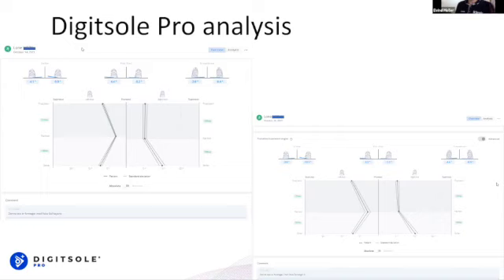As you see, the left foot is very perfect. Every step is always the same, and the same counts for the right side, with a bit more variation in her striking pattern. But this is really a smooth and very reproducible running pattern she has given.